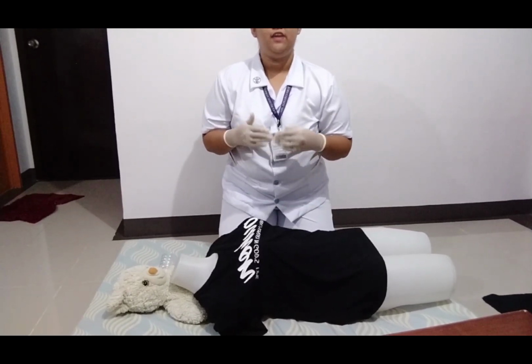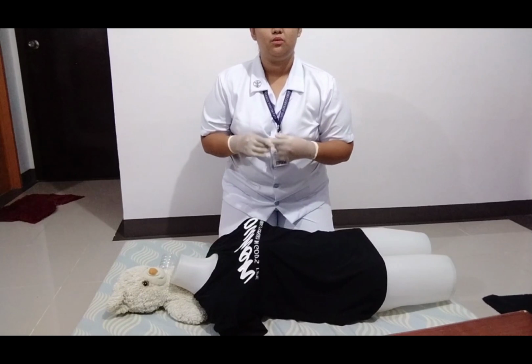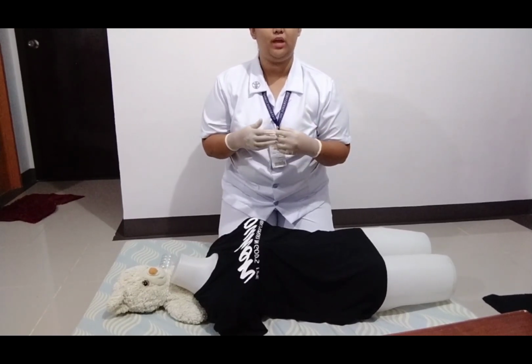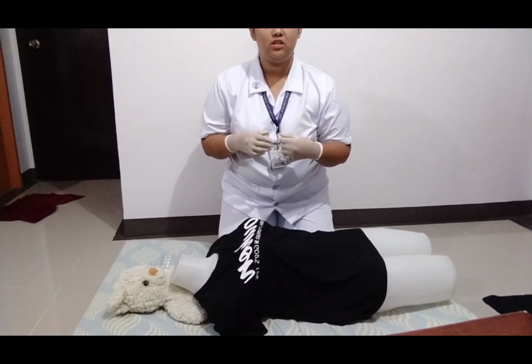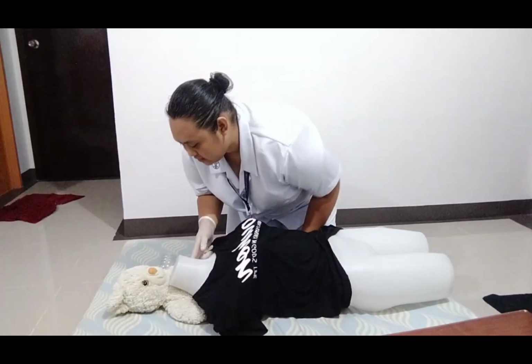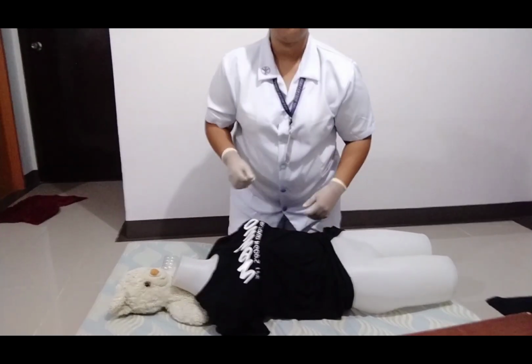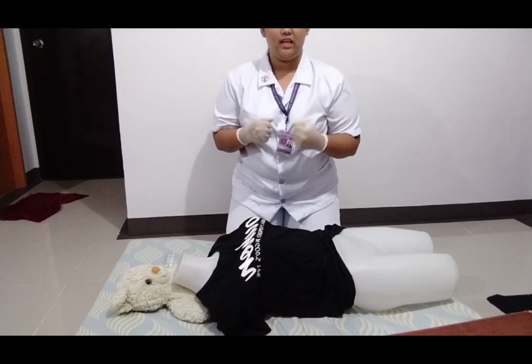If the patient is wearing constrictive clothing, we'll have to loosen it up. And we'll have to check the patient's mouth as well to see if there is anything that causes an obstruction of the airway. We also have to remove the dentures if there are any. So I'm going to check my patient's pulse and breathing. 1001, 1002, 1003, 1004, 1005, 1006, 1007, 1008, 1009, 1010. So I have determined that my patient has no pulse, is not breathing, and is unconscious.